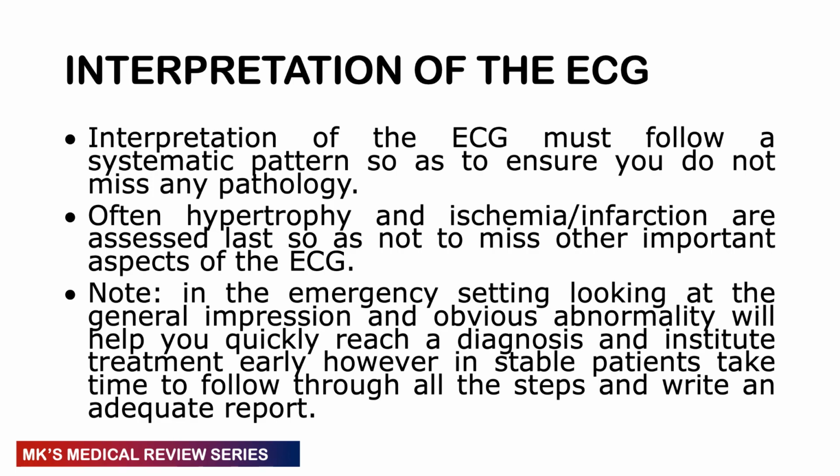In the emergency setup, it's very quick for you to get a good general impression of an ECG because you don't have the time to sit and actually write down a report, and you need to intervene very quickly. So you should have a sharp mind to pick up these diagnoses very quickly so that you can institute management. If the patient is a bit more stable, you can follow through the steps and write an adequate report whenever you're reporting your ECG.